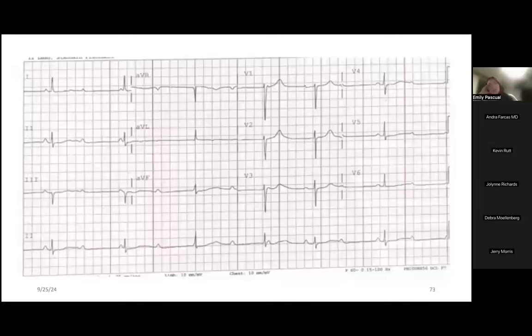I would say if she becomes hemodynamically unstable or you lose a ventricular escape, she would need to be transcutaneously paced, obviously. Atropine usually isn't super helpful for high grade AV block. It mostly works at the level of the AV node, so you won't really see that it's that effective. Sometimes it can make it worse.